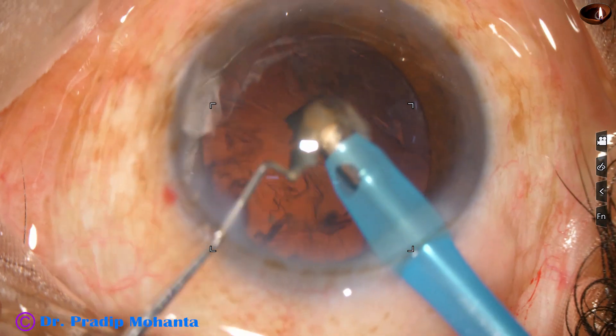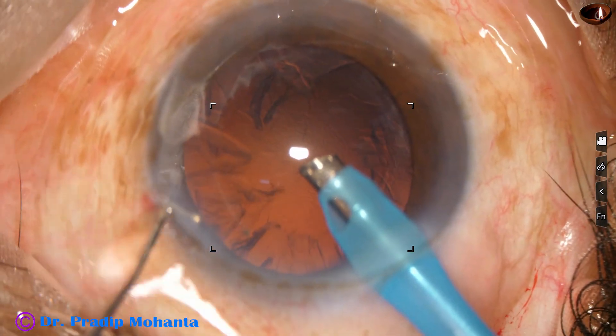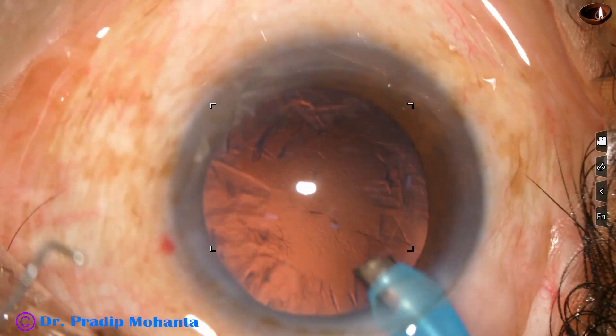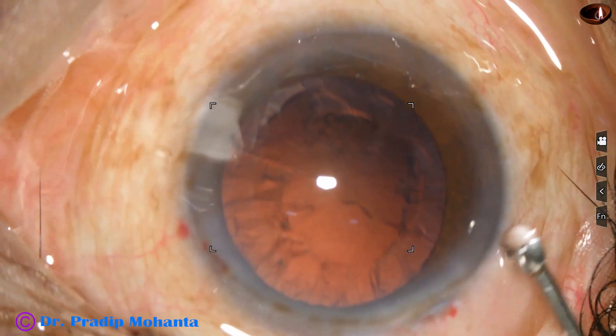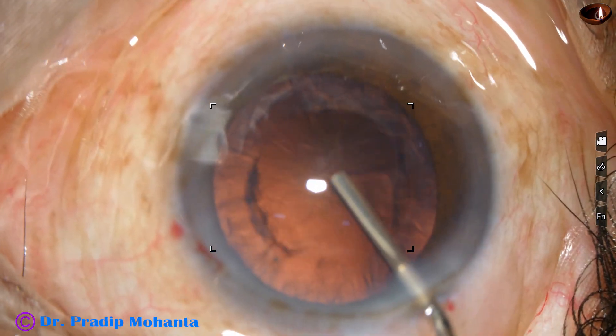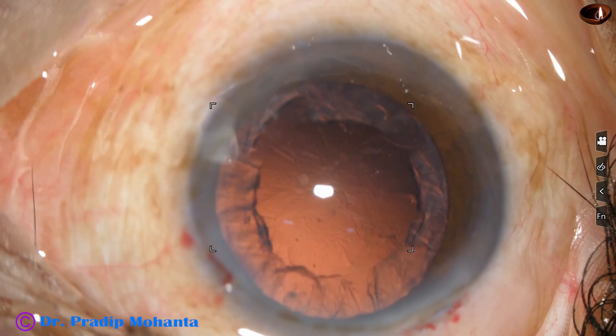Alternate between position 3 and position 2. And it is done — nucleus is managed. This is a totally unedited recording; you are not missing anything, this is in real speed.